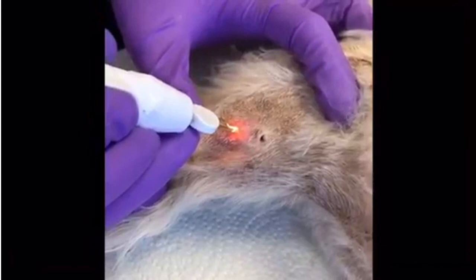That is actually a cyst that they want to remove. So no need for scalpel, no need for all that bleeding, because whenever your monopolar encounters a blood vessel, it coagulates it immediately.